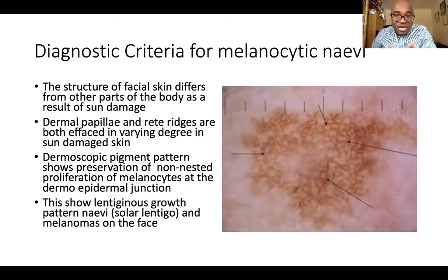In fact, most people use them interchangeably, that if you see a mole on the face, most likely it is a melanocytic nevus or solar lentigo, and again, you can actually distinguish by the regularities when you look deeply at the network, whether it is a melanoma in situ, when we come to pattern analysis.